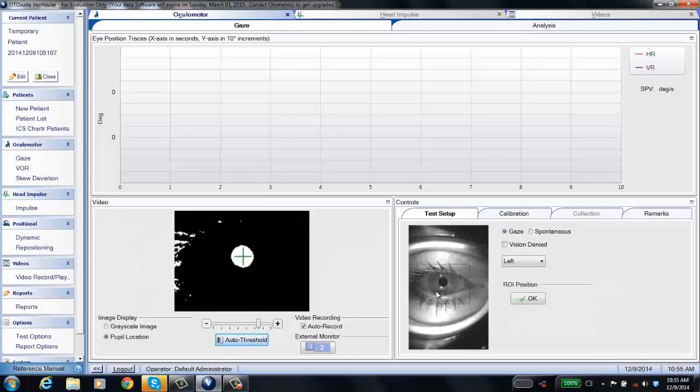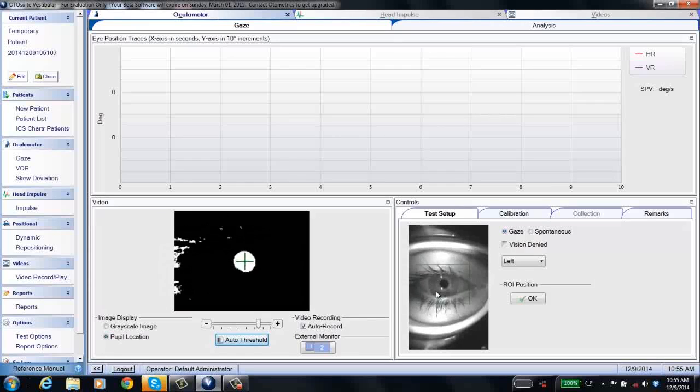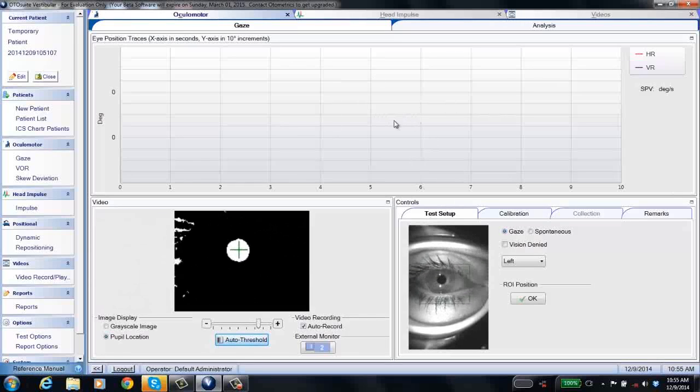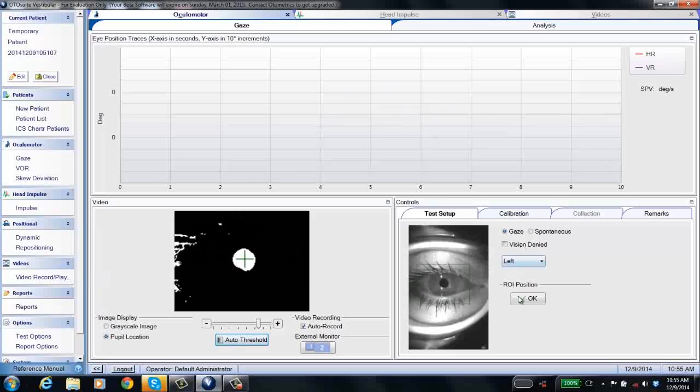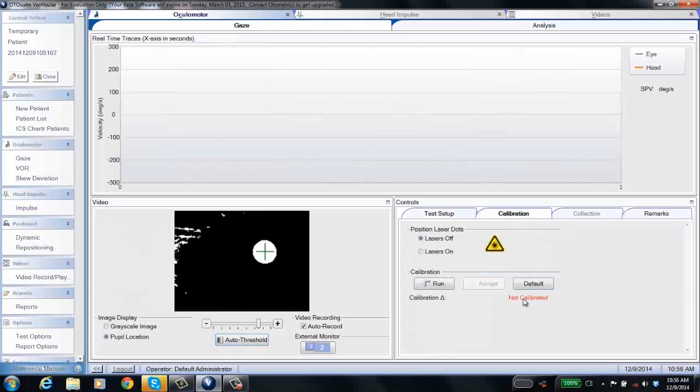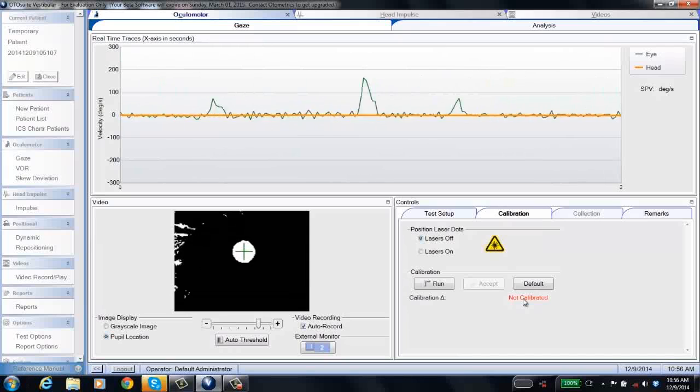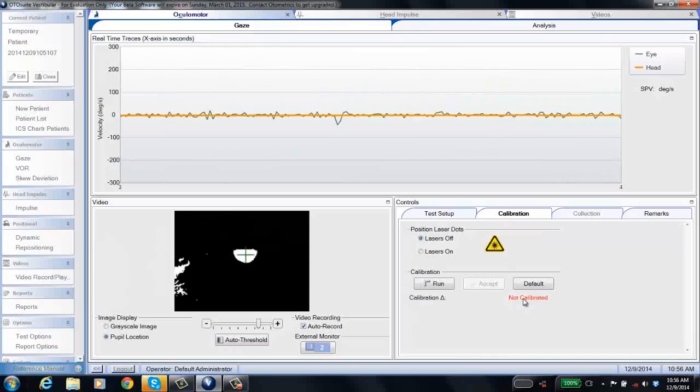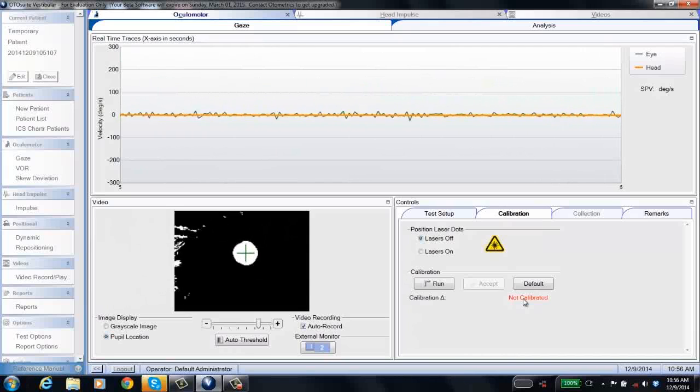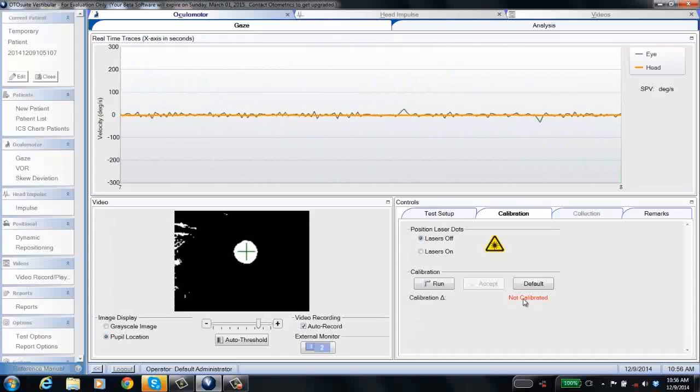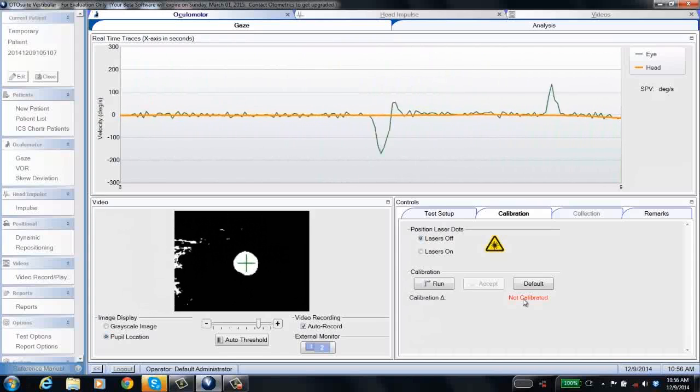Otherwise, all the pupil detection is exactly the same. The screen does look a little different for all tests. Outside of VHIT, you have a gray real-time trace window that shows you the eye in green and the head in orange. But the pupil detection procedure is exactly the same for all tests.